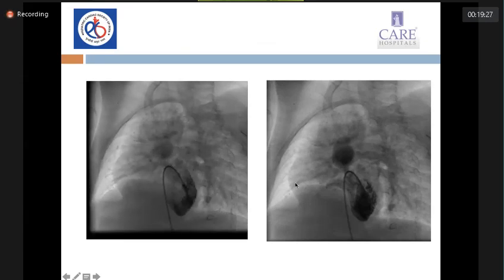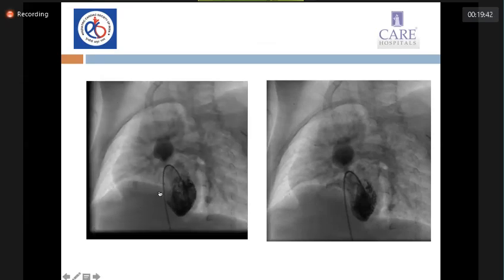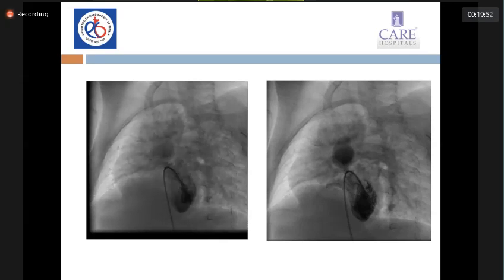So this is a different view. You can see the ventricular septal defect. Yes, sir. Now your questions are: what is the effective pulmonary blood flow in a D-TGA, VSD, PS? What is the effective systemic blood flow? What are the two communications which determine it? Can you briefly explain, or shall I take it next class?